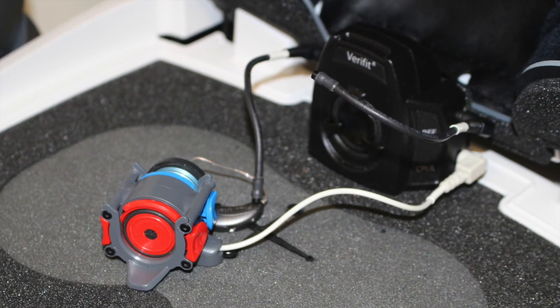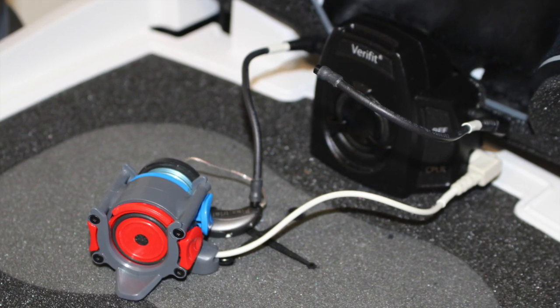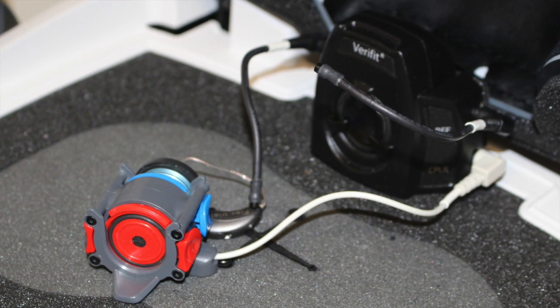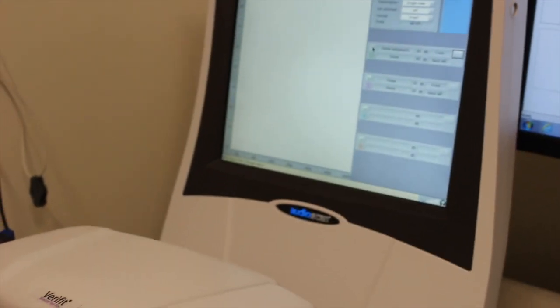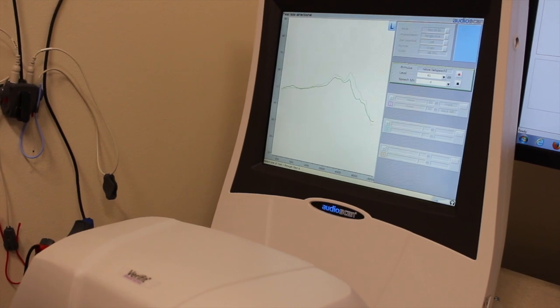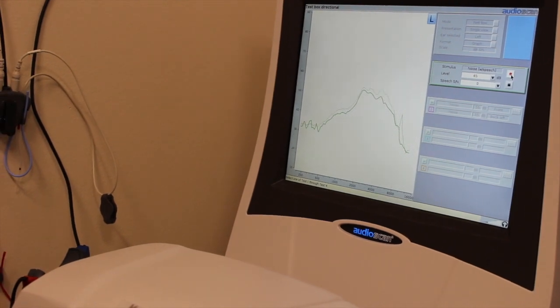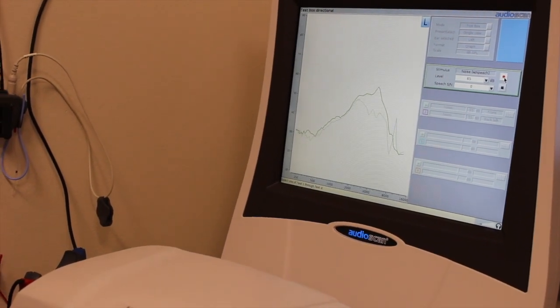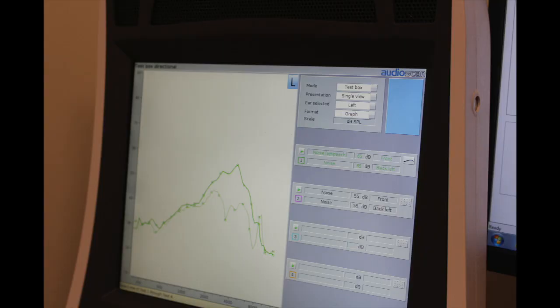You can see on the VeriFit screen the alternation between the omnidirectional and directional conditions. The thick green curve represents the output that is being recorded at the coupler microphone for the signal that is coming from the 0 degree azimuth front speaker in the test chamber. The second thin green curve represents the output for the signal that is coming from the back jamming speaker. These 2 curves separated substantially when the directional microphone capability was activated. We can clearly see that once the directional microphone has been activated, there is a significant favoring of output for signals coming from the front of the hearing instrument versus signals coming from the back jamming direction.